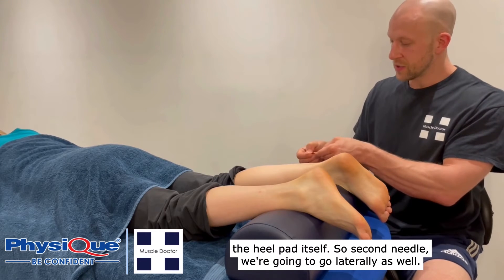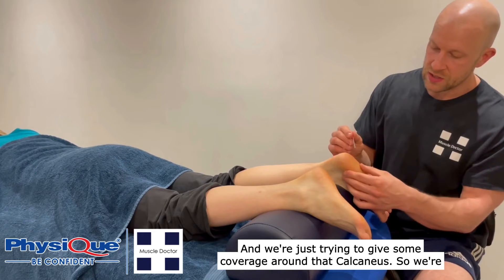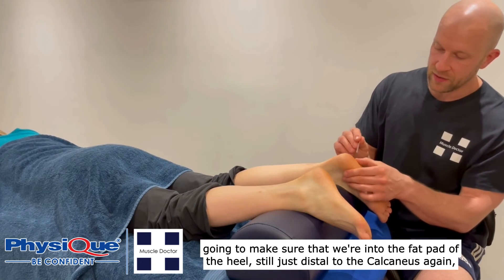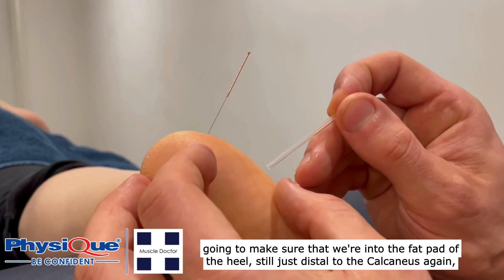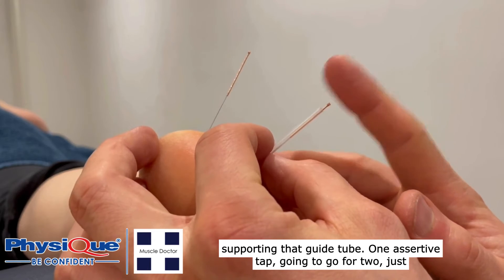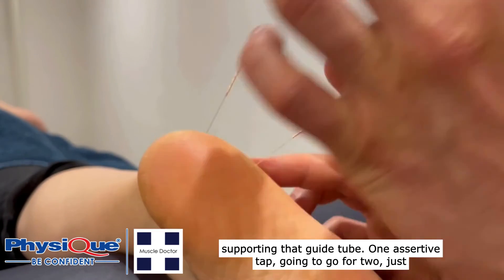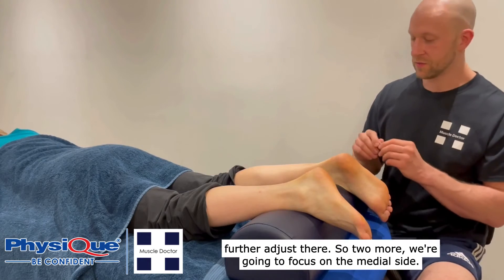For the second needle we're going to go laterally as well, just trying to give some coverage around that calcaneus. We're going to make sure that we're into the fat pad of the heel, still just distal to the calcaneus. Supporting that guide tube, one assertive tap — I'm going to go for two just to make sure that we're definitely in, and we are in. No need to further adjust there.